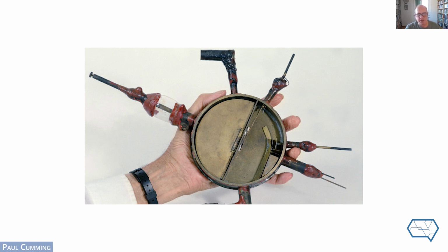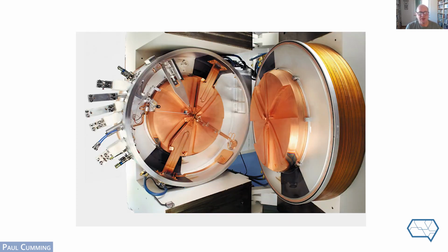And in the next slide, yeah, that's what I meant to show in this order. This is a modern cyclotron. It really shows the same principle, but this is a medical cyclotron specifically used for accelerating particles, protons in general, to generate synthetic radionuclides to be used for molecular imaging, such as PET.